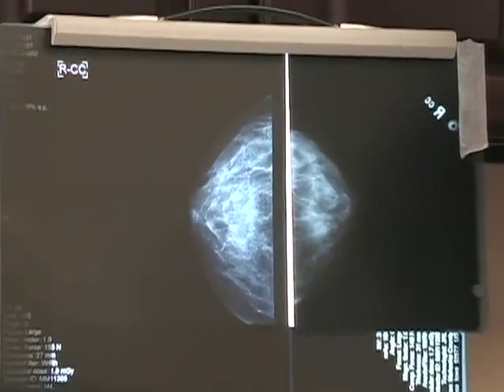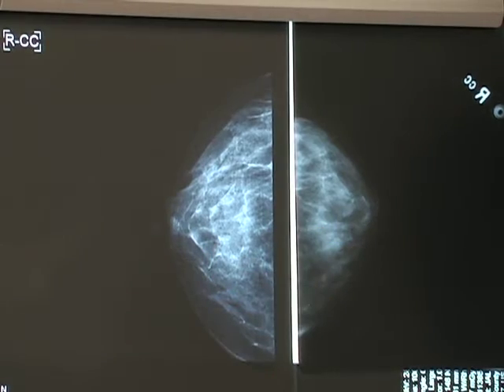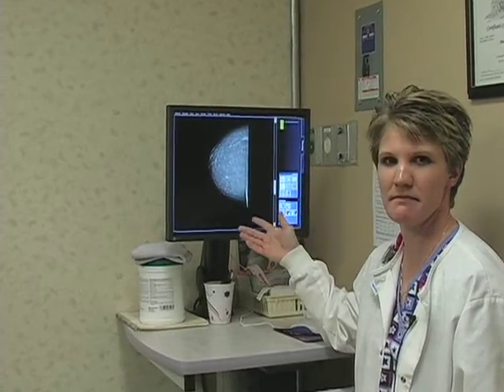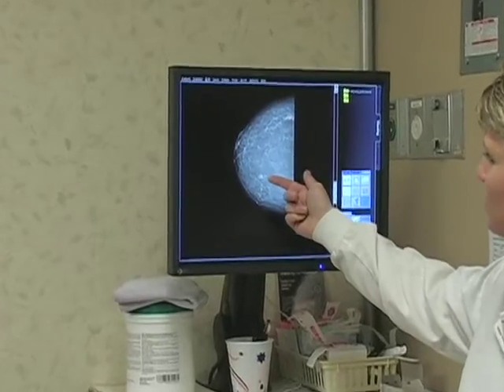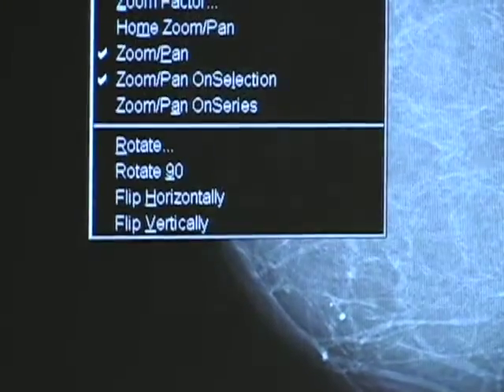This is a normal person's mammogram, so there's no abnormalities to point out, but this is a very good patient to show the difference between what screen film would do and what digital mammography would do for a patient. Julie Spears, who gives and interprets mammograms at the hospital, shows a digital image with a visible breast cancer mass. This is one of the views that we do, a standard view. And when we did these images, this area right here, this little whitish area, we can mag that up just a little bit too.